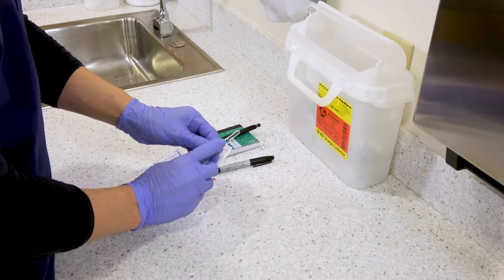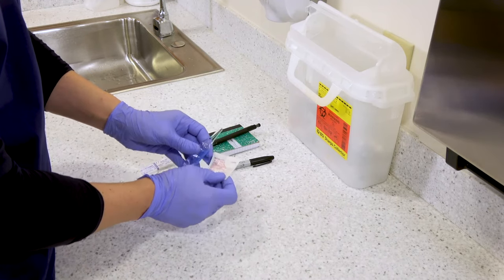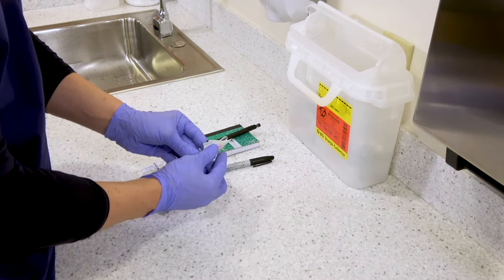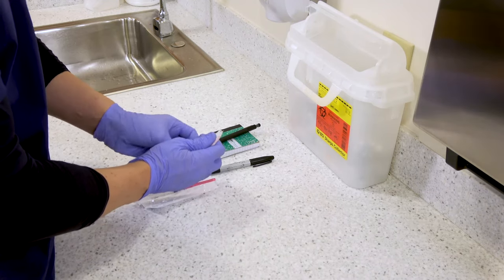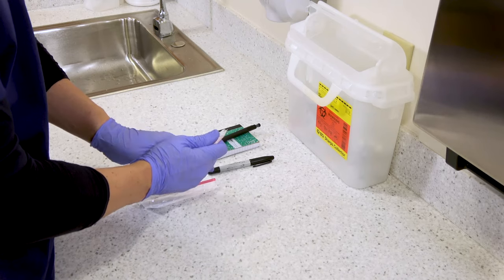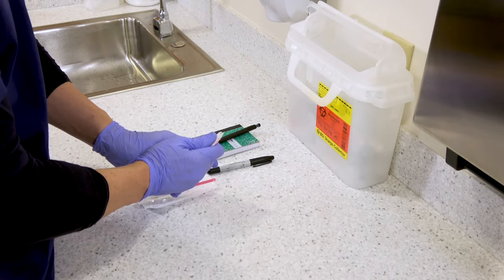Now you want to look at the top of the ampule and see if there's a little dot on it. If so, that is where you want to plan to put your thumb. You're going to wrap a piece of gauze around the top of the ampule, or you can even put the top of the ampule into an alcohol pad package.